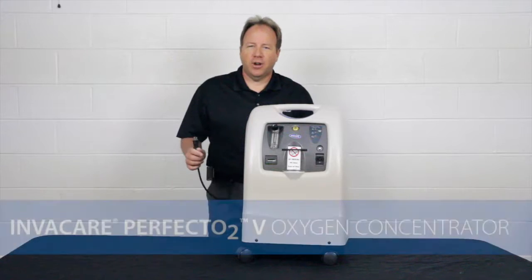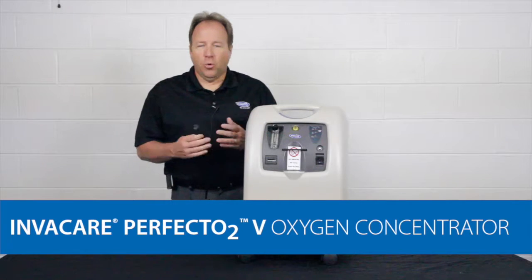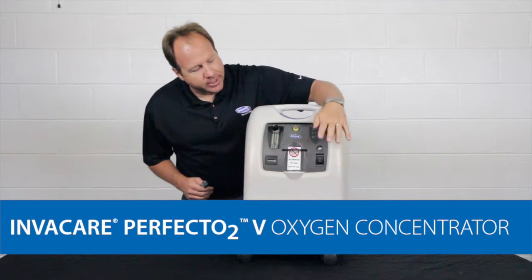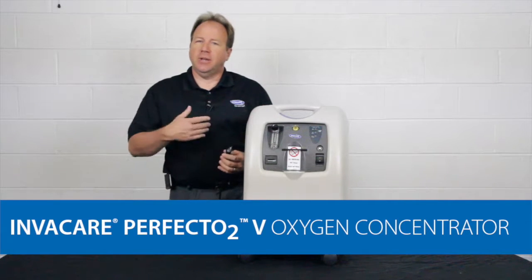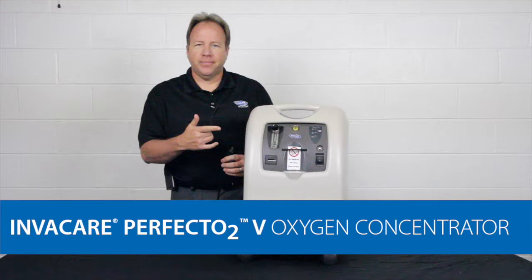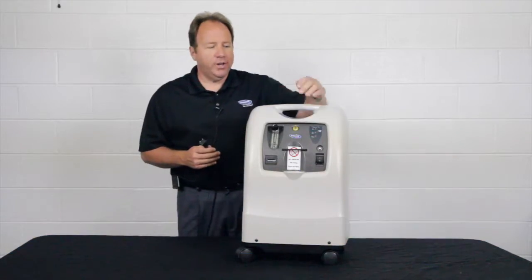Hello, another tech tip we want to talk about today is if you ever try to turn on your concentrator and it doesn't start up, you're wondering what has caused the problem. You may turn the concentrator on, hit the on-off switch, and what's going to happen is you're going to get some beeps — a power loss beep — which will be an intermittent beep, as you're hearing right now. This is telling you you've lost power, so we want to do some investigation and find out what has caused it.